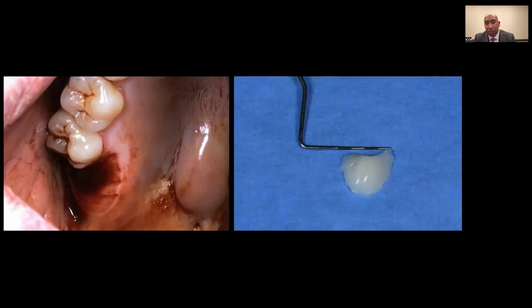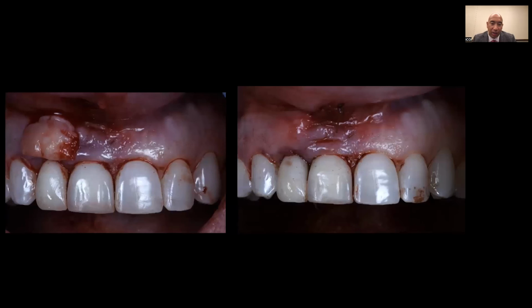Just like the previous case, I also like to use a tuberosity graft like you see here. And that's what it'll look like. Quick reminder, you've got to make sure you de-epithelialize that, take the skin off of the tuberosity graft so that you're left with nothing but connective tissue. I do that with usually a fresh 15 or 15C blade, and sometimes I'll use a round diamond burr. But anyway, it's going to go through the frenum anterior tunnel.